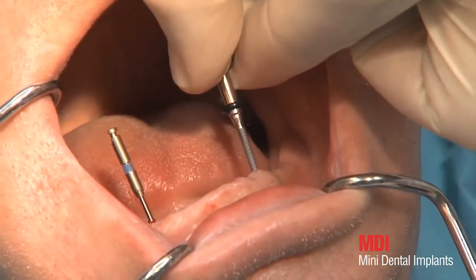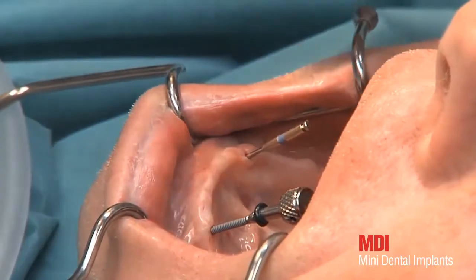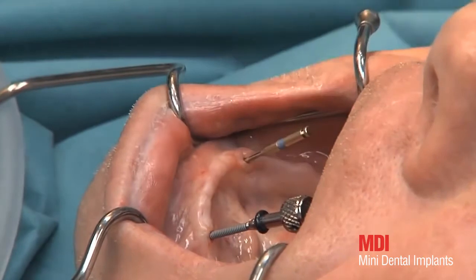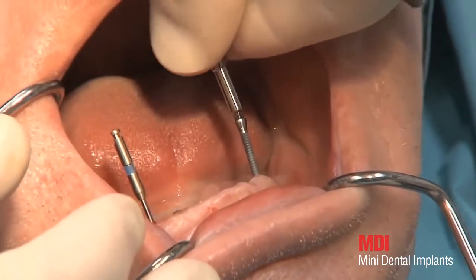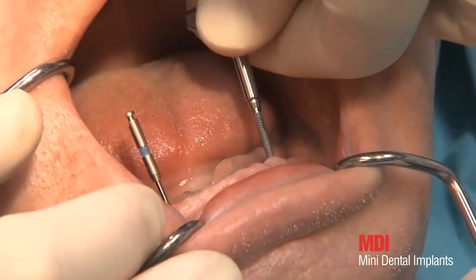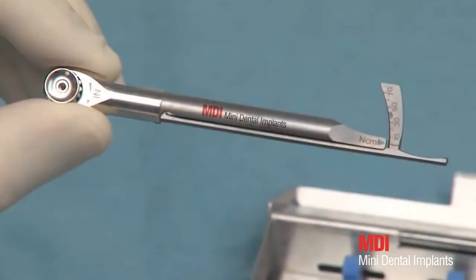The finger driver allows a sensitive insertion and minor corrections to the angulation if necessary. Once the resistance gets too high, the next instrument, the winged thumb wrench, is used. The winged thumb wrench allows higher forces to be applied. For the last windings and final position, the graduated torque wrench is used, thereby determining the final torque for control.